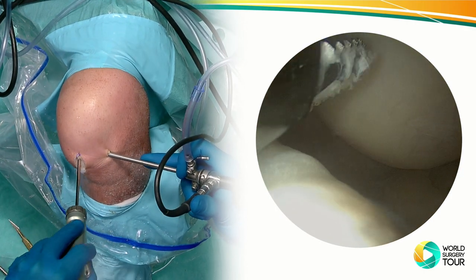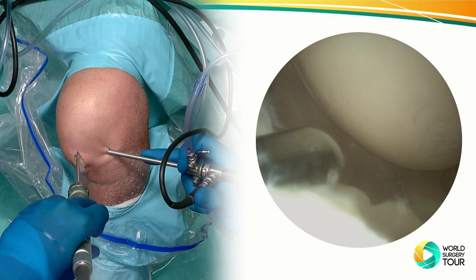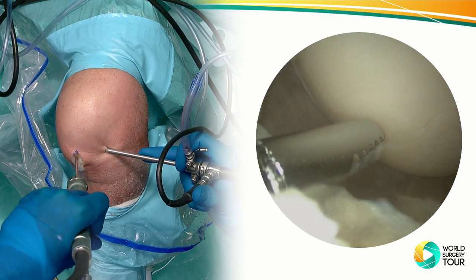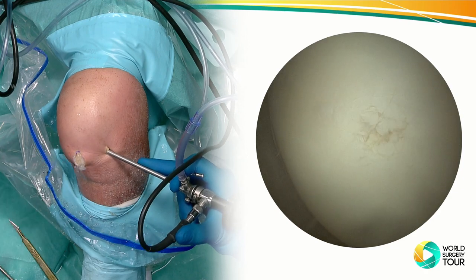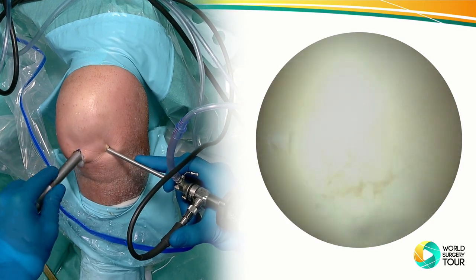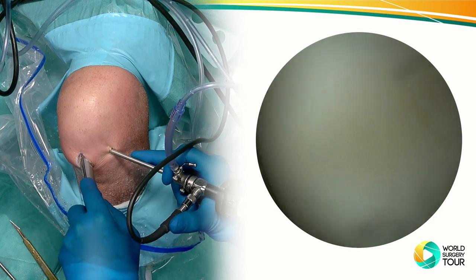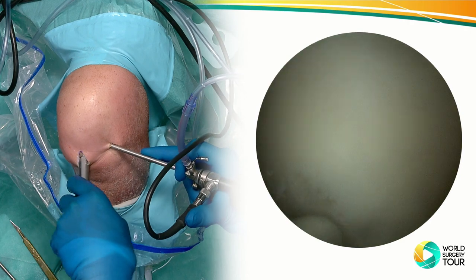Go for a little bit of inflection. Okay, here we go. Once the cannula is in, everything becomes easier. If you're not 100% sure it fits, then don't continue. Okay, let's do it again. Yes, here we go. Okay, that looks great, perfect.